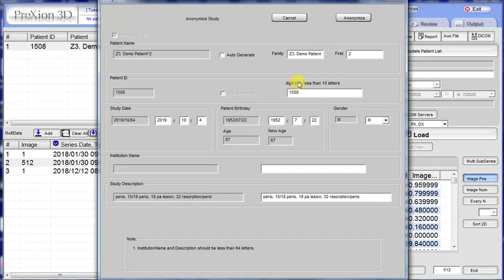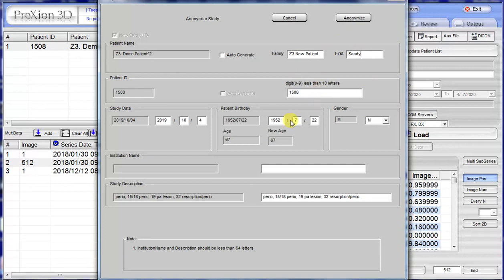Anything in the white boxes we can change. Let's make a few changes. So let's say Z3 — we'll just call this 'new.' You can change the name, the first name as well. Anything in the white boxes you can change. Give it a different birth year.